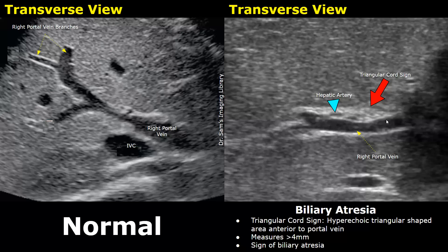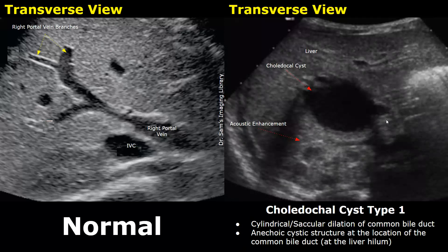A choledochal cyst type 1 is a cylindrical or saccular dilation of the common bile duct. An anechoic cystic structure will be seen at the location of the common bile duct at the liver hilum. The cyst will also give posterior acoustic enhancement.